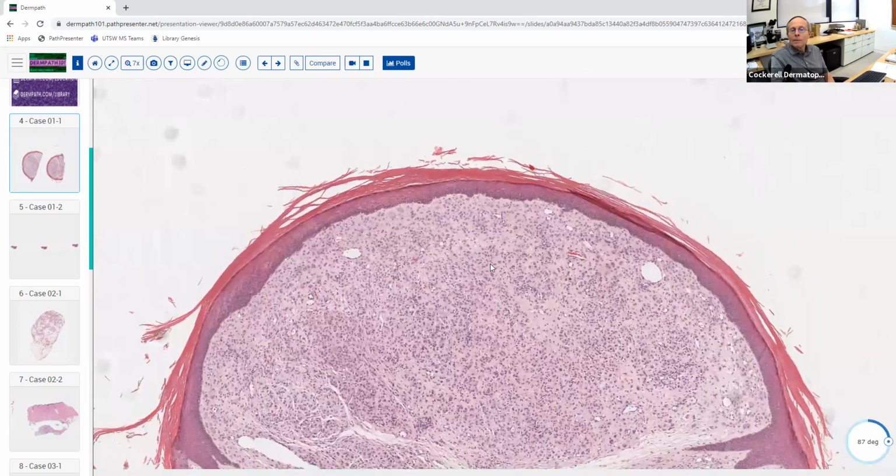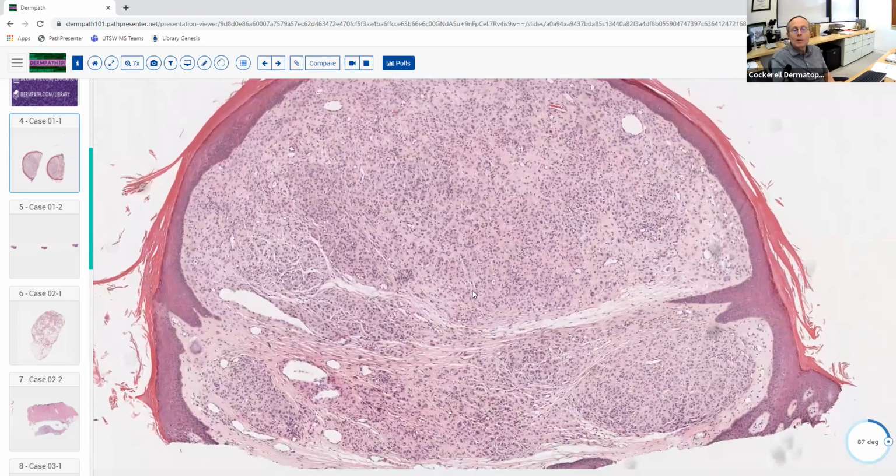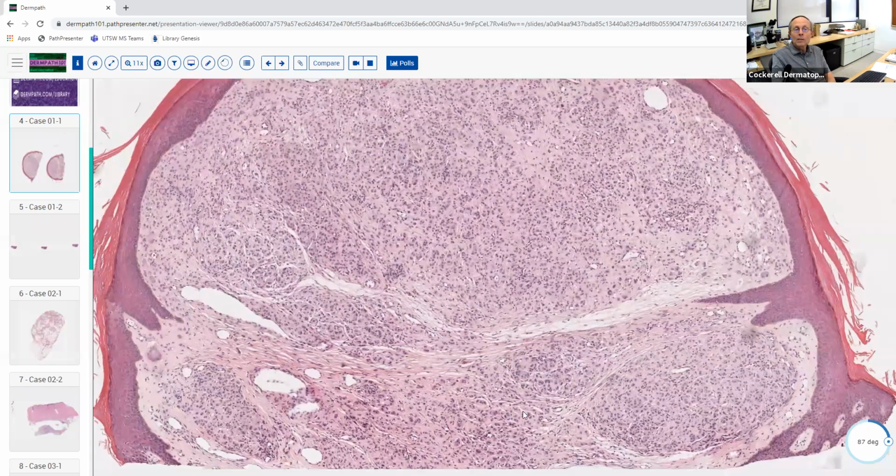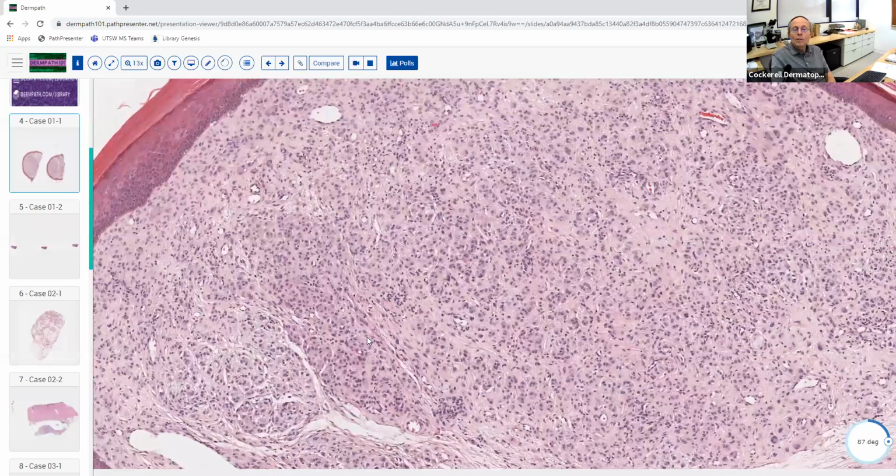So I was talking about juvenile xanthogranuloma. I mean, this might be adult. You get plenty of these in adults too, but this is an example of a xanthogranuloma. Okay, so it's a nice characteristic example of that. Sometimes they have more Touton giant cells than others.